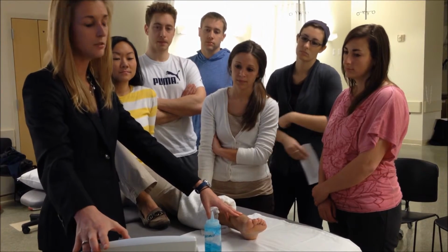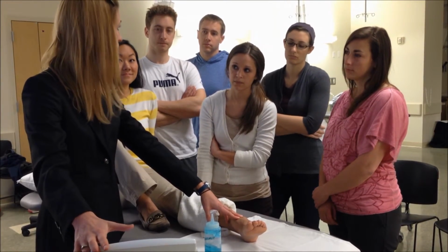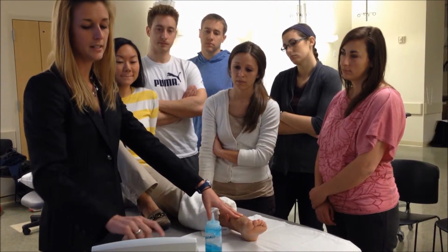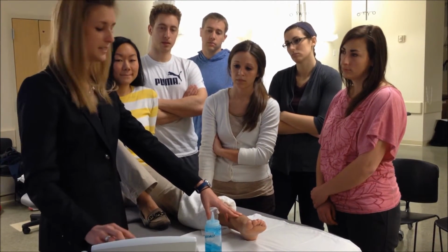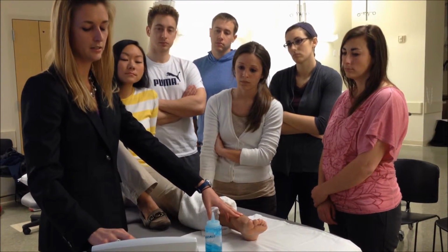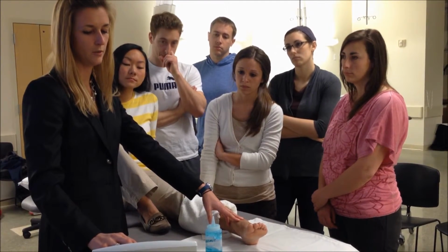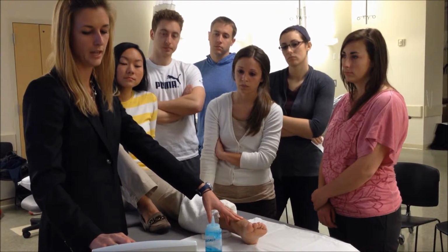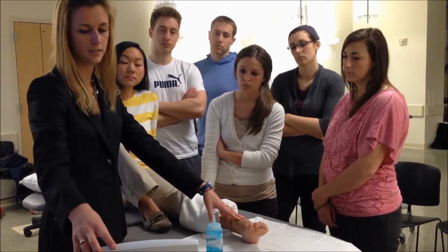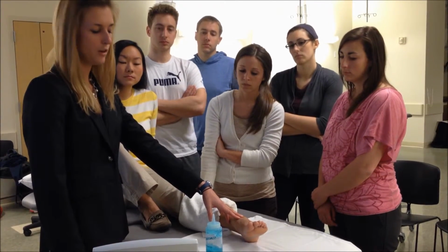Our duty cycle is 100%. We want it continuous for thermal effects, so that's okay. Now our intensity right now is at 0, so to adjust intensity, we're going to turn this knob here. Again, this is based on patient tolerance, so we're going to try a 1 to start. Anywhere between 0.5 to 2 is okay. Treatment time, we're going to adjust that to 8 minutes. And we're ready to go.